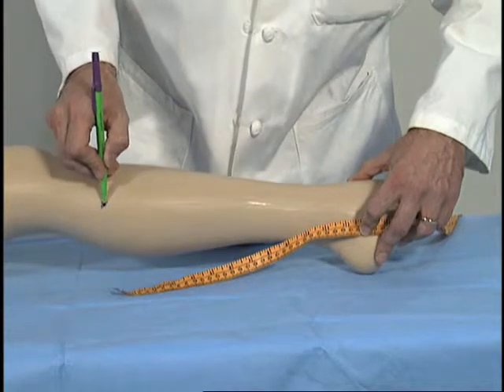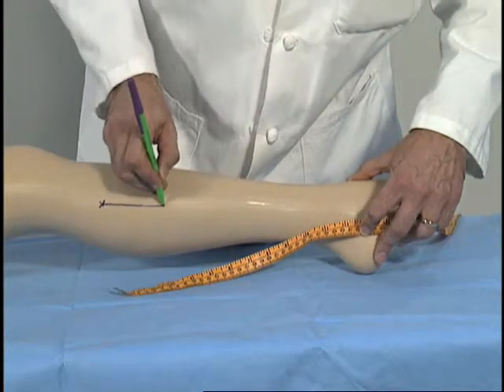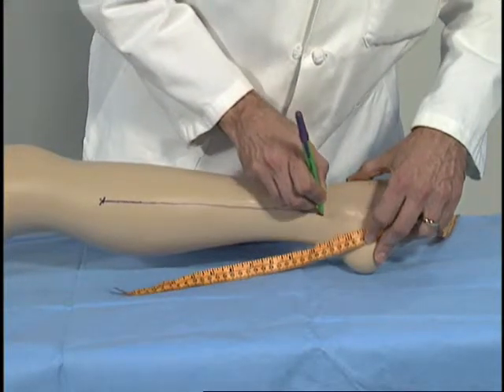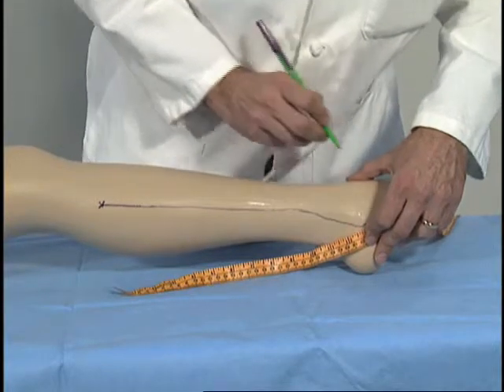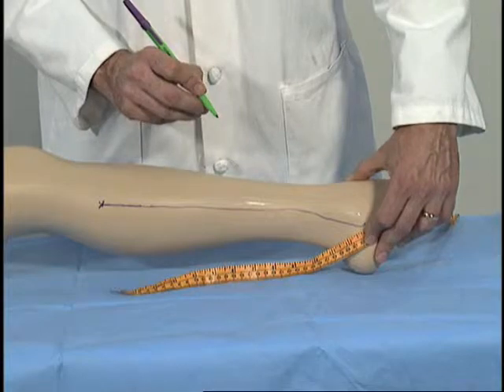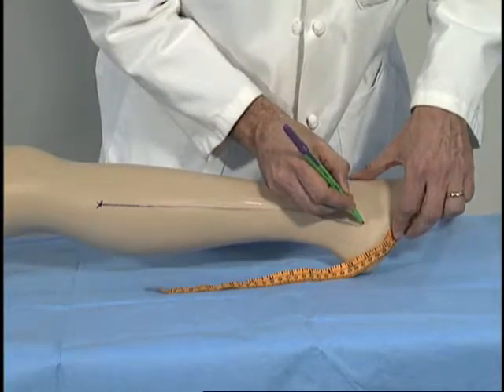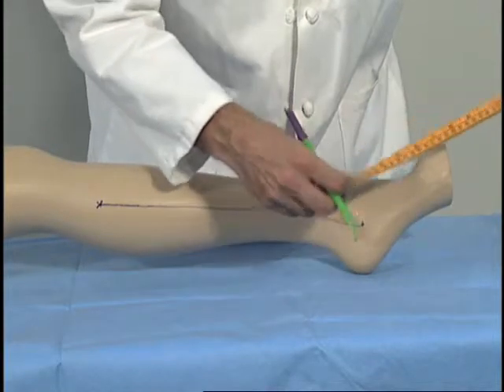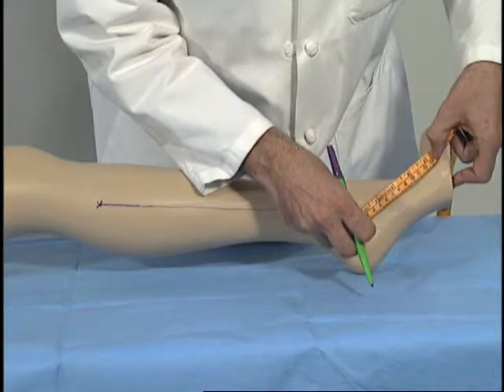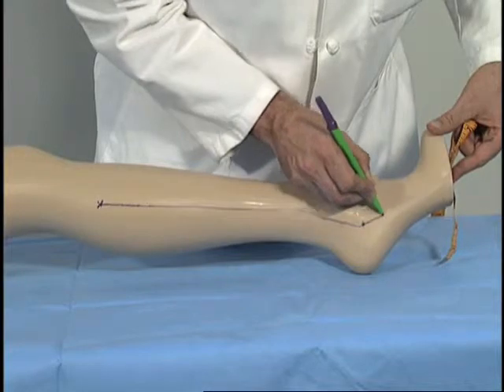Our line is made in the typical position that you would use for a medial approach to the posterior tibial or peroneal artery when approached surgically. We'd be moving off the edge of the tibia 2 to 4 centimeters in your usual surgical approach. The distance then from that spot on the ankle to the great toe is another 15 centimeters in this case.